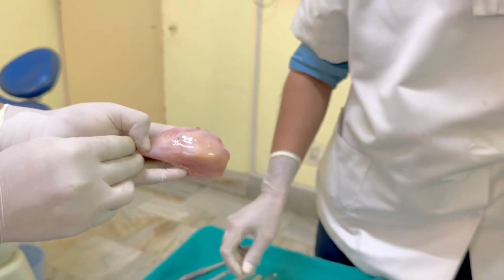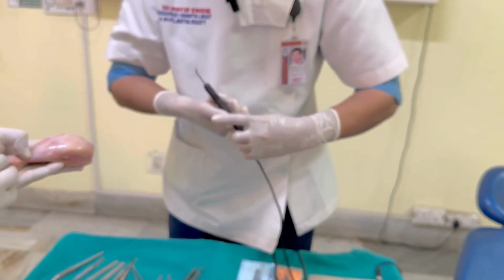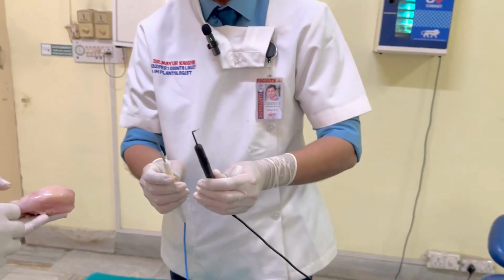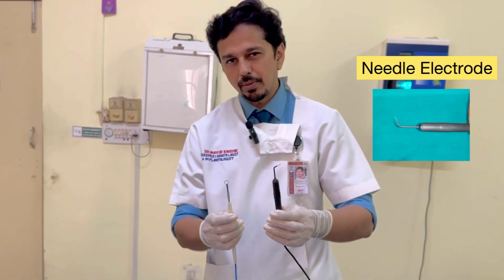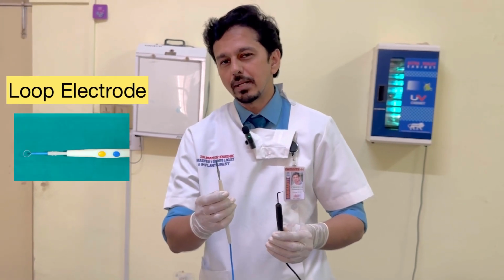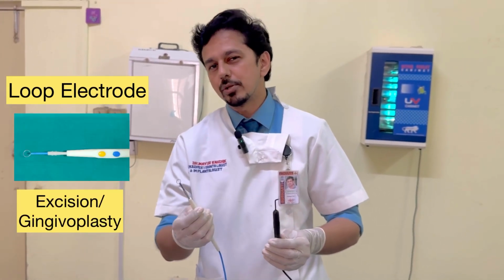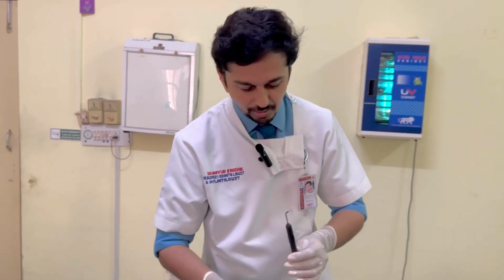So whenever we talk about a thermal modality like electrosurgery, there are basically two types of electrodes that we use in electrosurgery. One is a needle electrode, which is used for incision. One is a loop electrode, which is basically used for excision and superficial deepithelization. So let us see the incision part first.